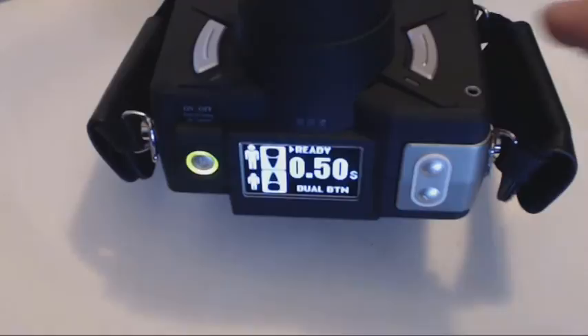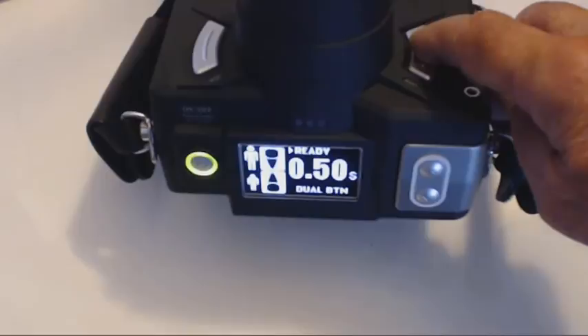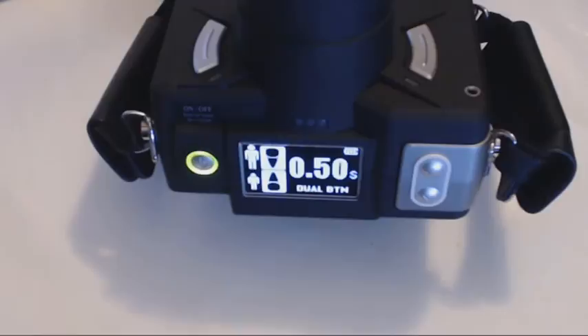To make an exposure, press and hold either the button to the right of the cone or the button to the left of the cone. Watch the top of the display to see the word exposure appear briefly for the actual exposure time, after which the button may be released. When the word ready reappears, the unit is ready for another exposure.